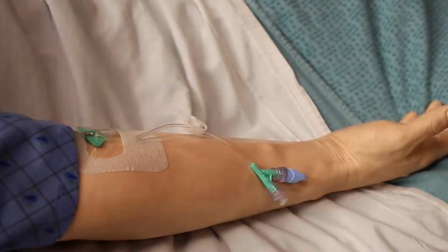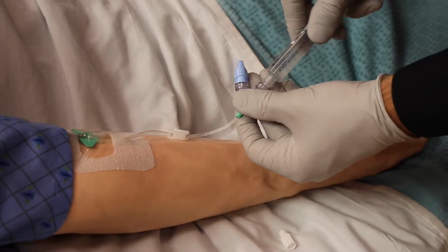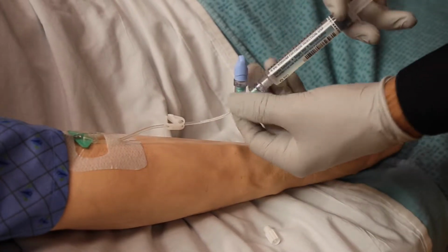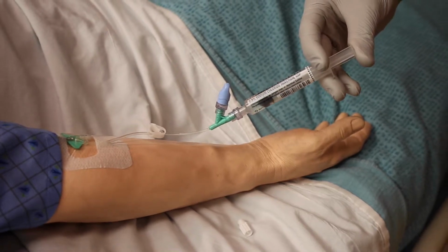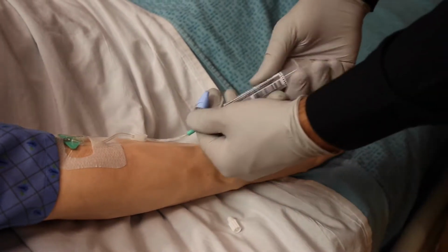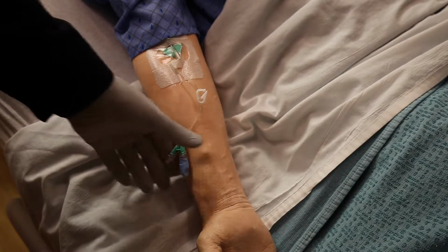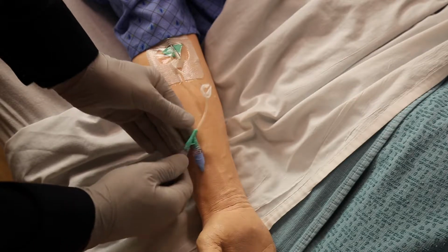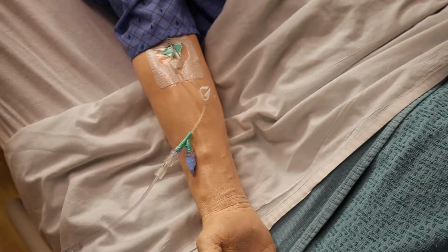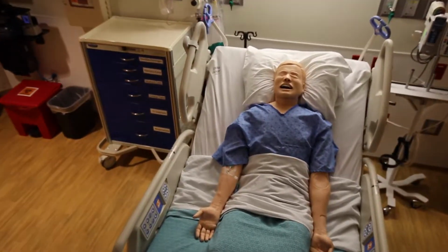If IV access is available, your patient will have an IV already placed. If you need to administer a medication, do not verbalize and pretend. Please actually push the medication and use the IV access that is available. The same is true for any fluids that need to be hung. Any fluid that is pushed into the mannequin is collected in a drainage bag behind the bed. If you see this drainage bag during the simulation, please disregard it and pretend it is not there.